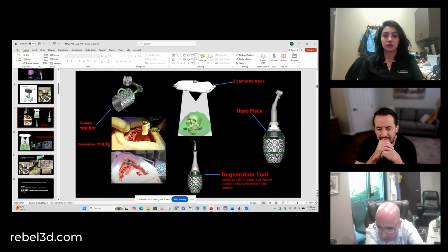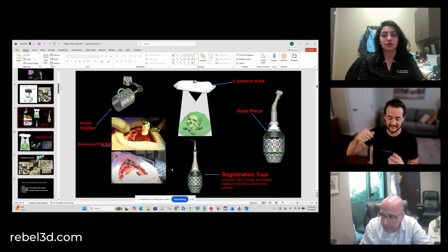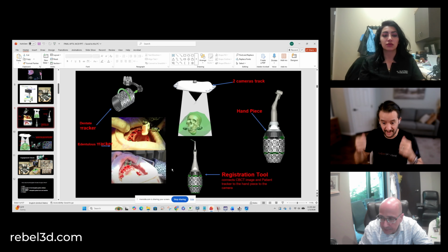The satellite has to have some fixed points in the mouth that are the landmarks by which it knows, even if the patient's moving slightly, it's following those landmarks so that at all times your car stays on the road, or at least the road you want to drive. And how to do that?